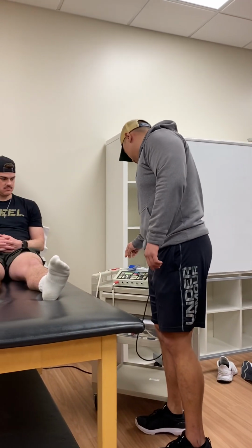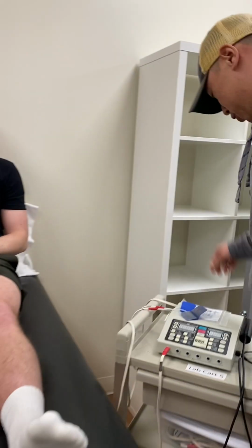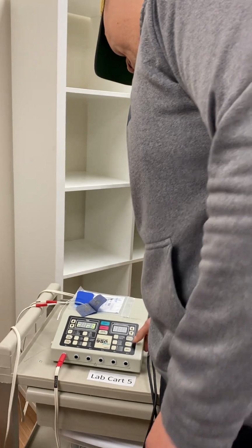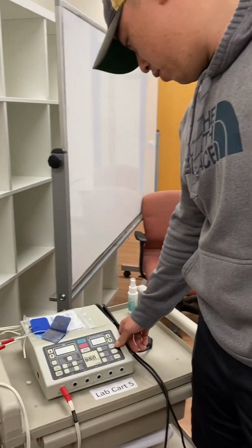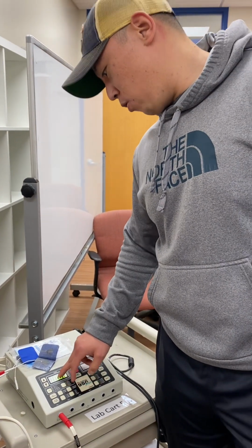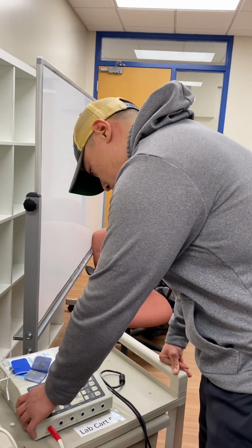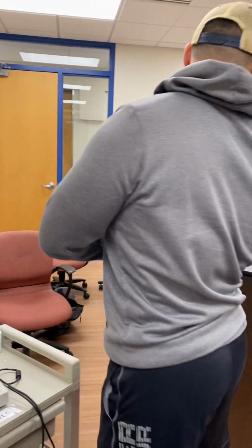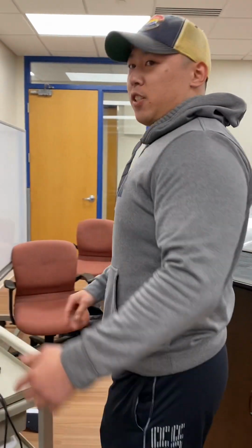Coming over to the machine. The first thing we're going to do is turn it on. Give this a second to boot up. So we're going to be using biphasic. We're going to be doing a total of 10 minutes. Rate's going to be 50, and the pulse duration, pulse width is going to be 200 microseconds. The duty cycle is going to be 1 to 3.